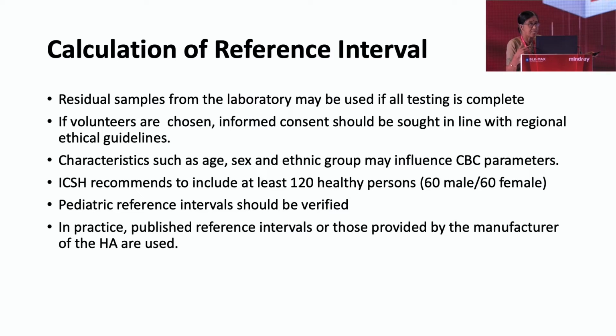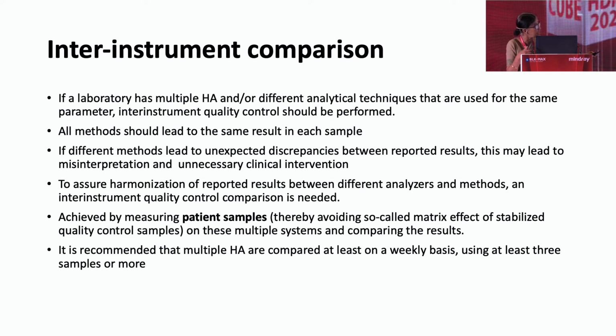The next aspect that we need to discuss is the calculation of reference interval. So, as desired by the standards, it's important that each laboratory establish their own reference intervals. However, having said that, it's going to be a challenge, particularly in pediatric patients. So, published reference intervals and those provided by the manufacturers are quite often used by all the laboratories.